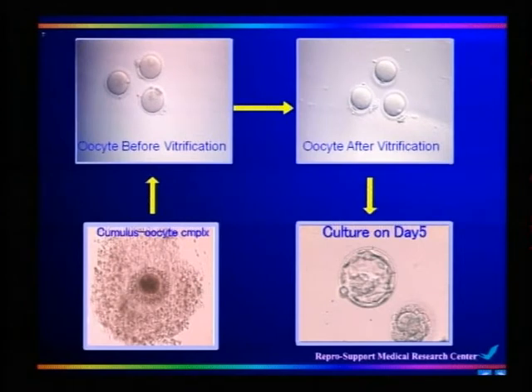I used this slide 12 years ago, in 2000, at the Japan Society. When I published this one, no one believed. The people said Masa did copy and paste in the slide, because 10 years ago, in the textbook, oocytes could not be frozen. Okay? No one believed, of course. But no, it is not copy-paste. It is the actual photo.